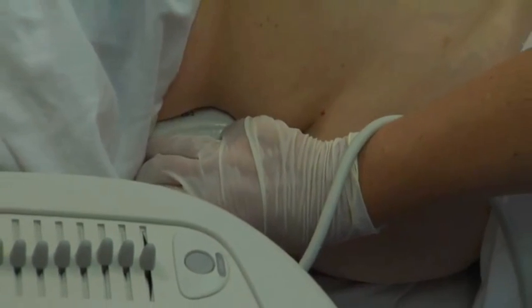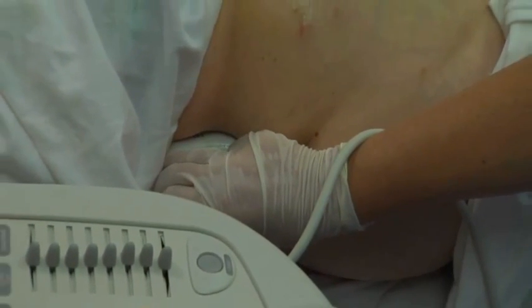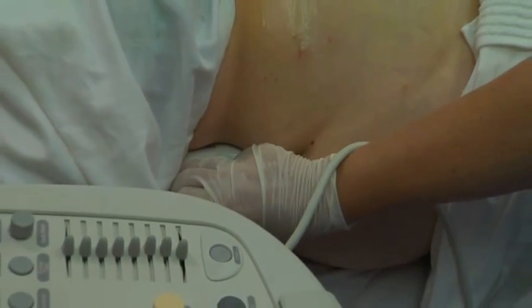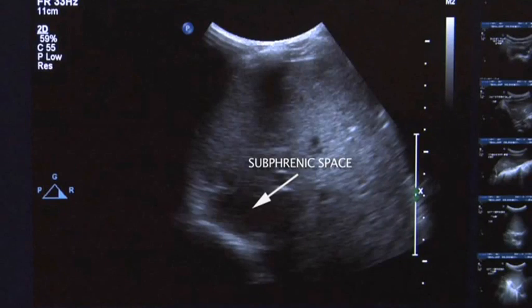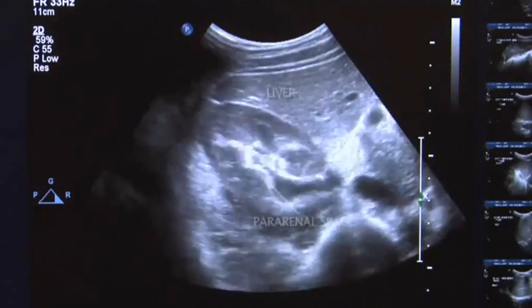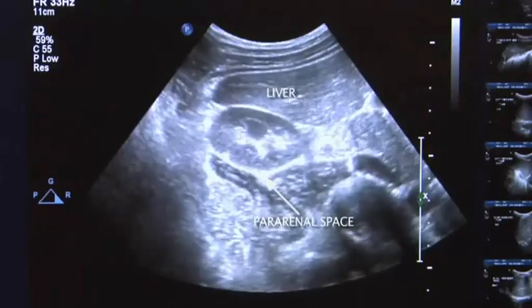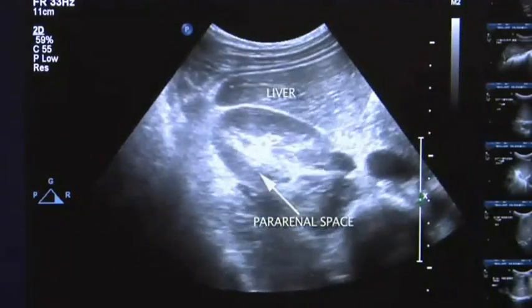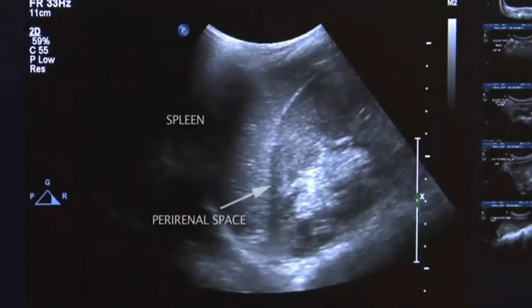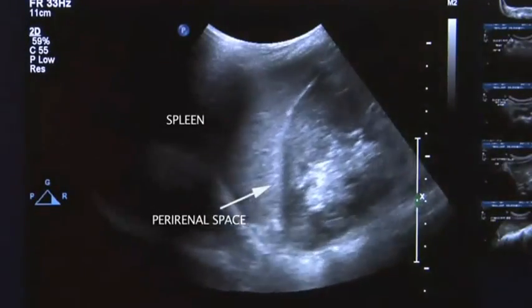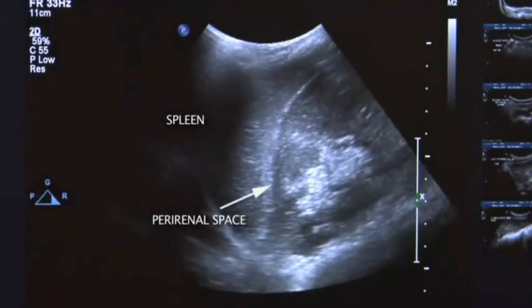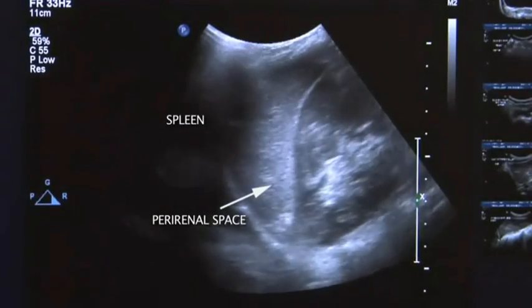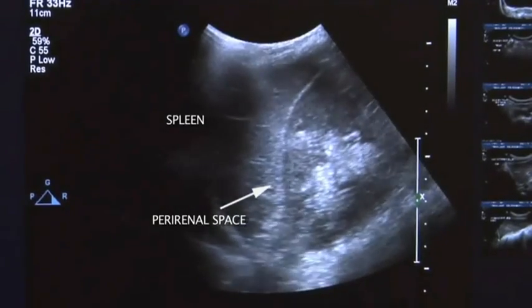Scan the subphrenic space by placing the transducer intercostally to identify any fluid or mass in the area. Using the liver as an acoustic window on the right and the spleen on the left, scan the perirenal and pararenal spaces in the longitudinal and transverse planes.